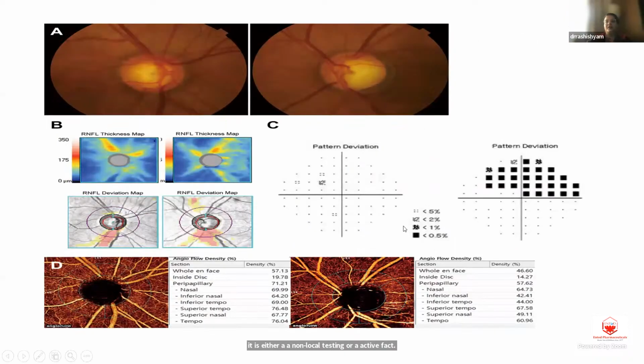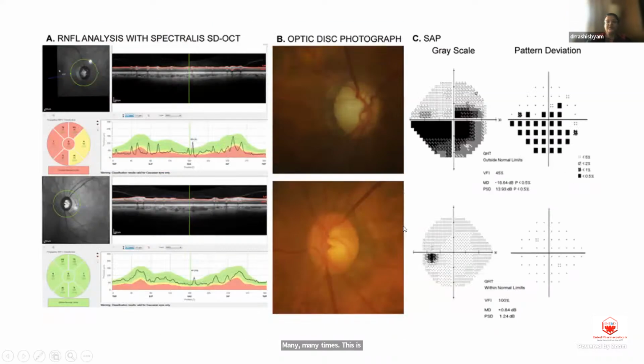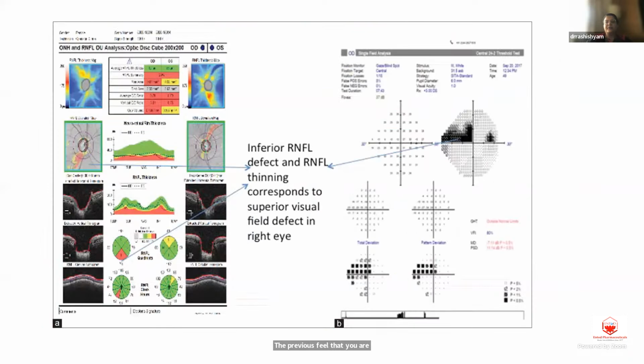Dr. Abhishek, correlation with HRT. Yes, Dr. Abhishek, sorry to interrupt you. The previous field that you're showing, it is more like it's respecting the vertical midline, don't you think?